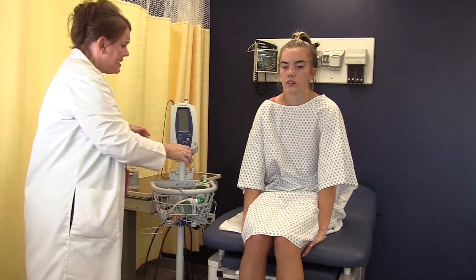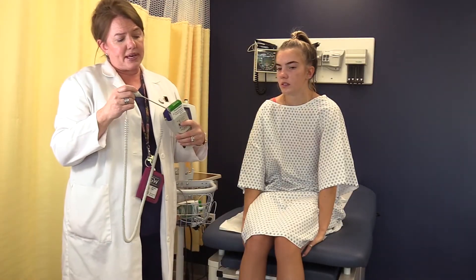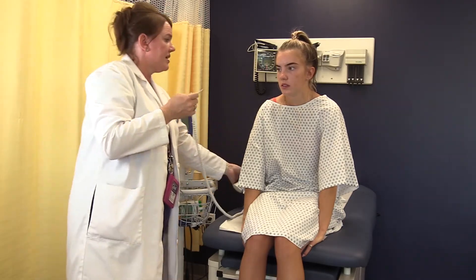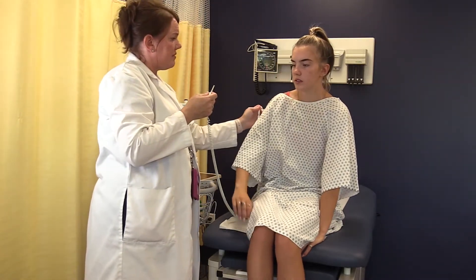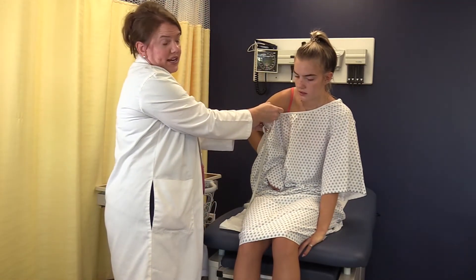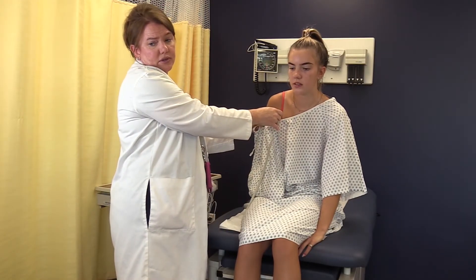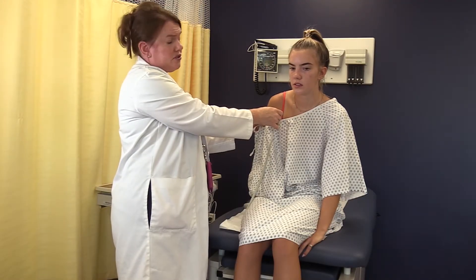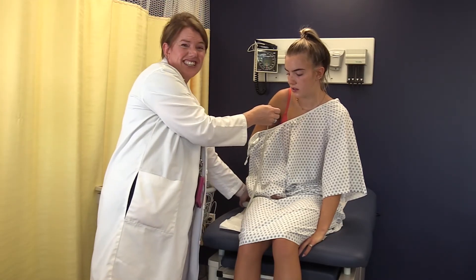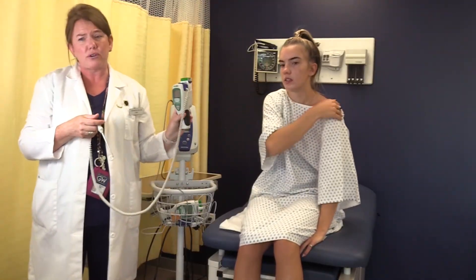Axillary also uses the blue probe and is taken in the armpit. Go ahead and sheath it. Lift up your armpit — I'm going to put it right in the middle, then go ahead and relax your arm. You can hold it or have your patient hold it, whatever is easiest. Wait until it beeps. The reading is 97.9. You can see how that corresponds to her 98.5 oral temperature.